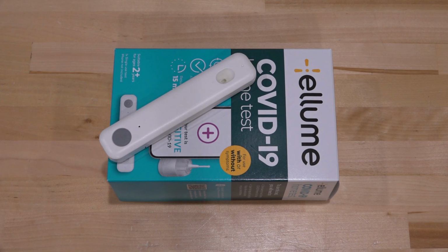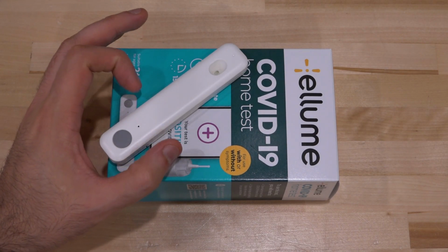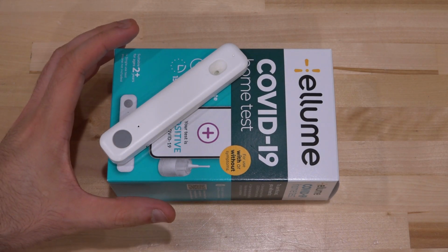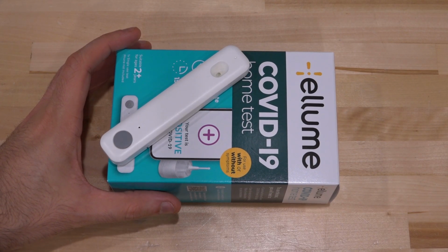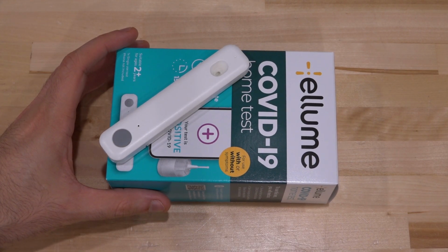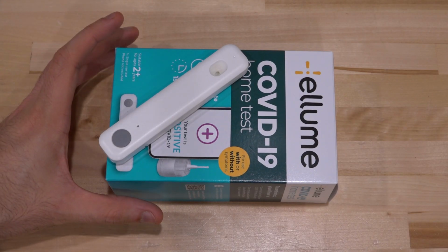In this episode, I wanted to take a look at one of these electronic COVID-19 home tests that you can buy. This particular one connects to your phone and it tells you on your phone whether you have COVID or not. Now, the way to use it is very similar to a PCR test. Now, these are not, of course, PCR-based ones.